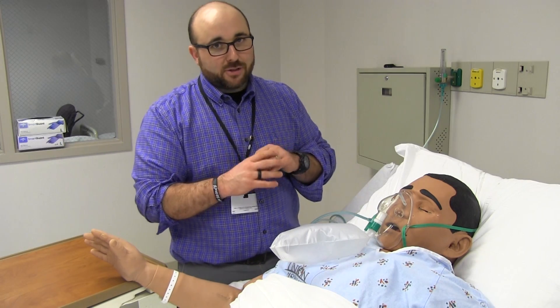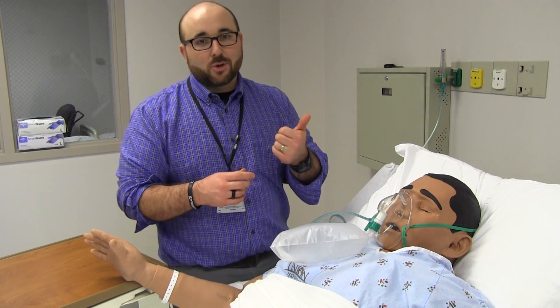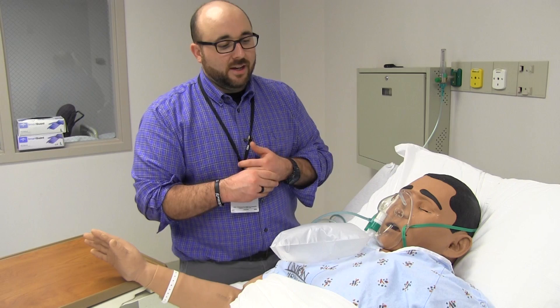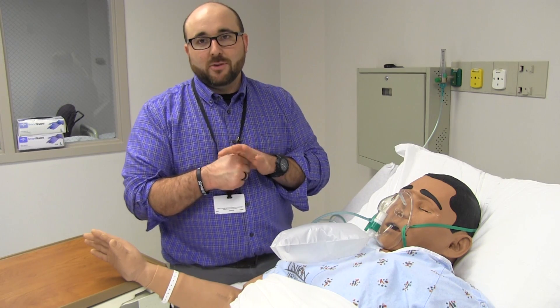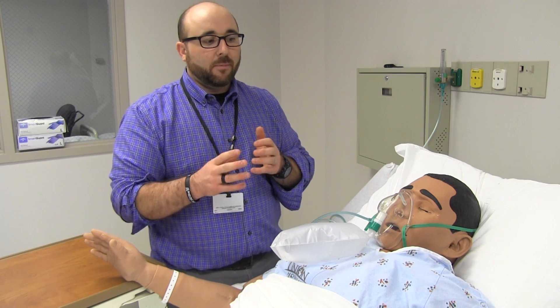Remember, a non-rebreather is temporary. You can leave them on it for a while, but they're going to need something else — either ventilatory support or non-invasive ventilatory support — because this is a very high amount of FiO2 that you're delivering. In transport it's great, but not for long periods of time.